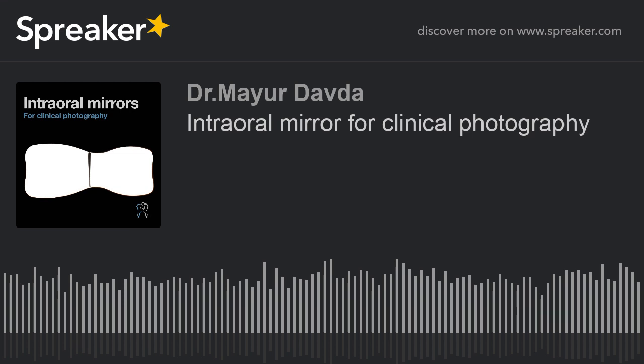One more thing that I would probably want to emphasize is how to use the mirrors. If your mirror is contra-angled, the side that we use for documentation is the convex side and not the concave side. Just keep that in mind because this is a very, very important point.